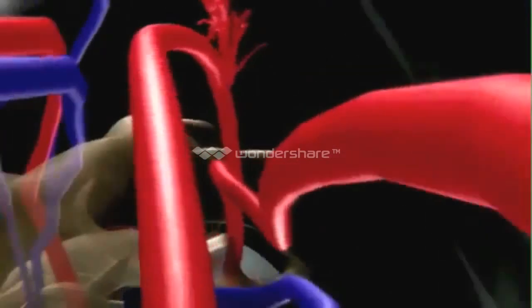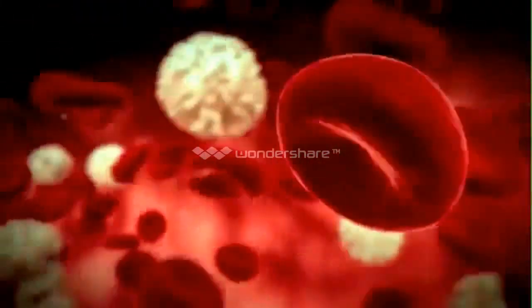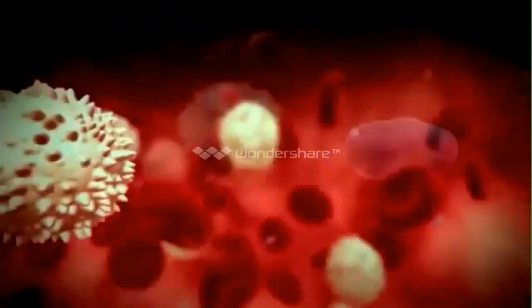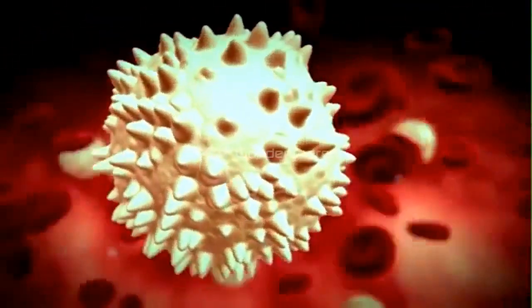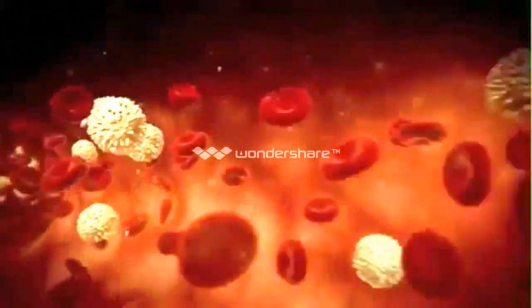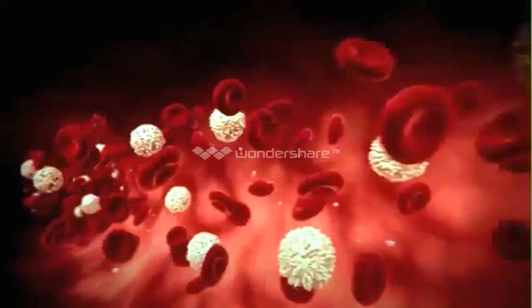The packed cell volume, or PCV, hematocrit, is a measurement of the ratio of the volume occupied by the red blood cells to the volume of whole blood after centrifugation in a sample of capillary or venous blood, expressed as a percentage. It closely reflects the hemoglobin and RBC values. The hematocrit in percentage points usually is about 3 times the hemoglobin concentration in grams per deciliter, when the RBCs are of normal size and contain normal amounts of hemoglobin.